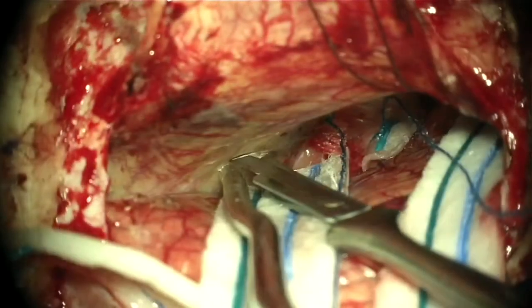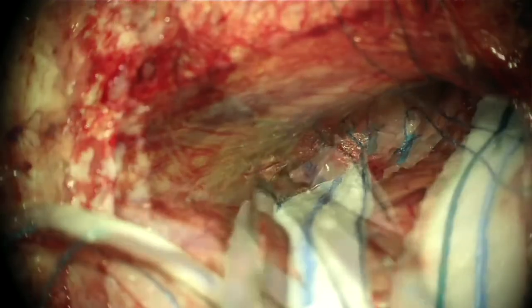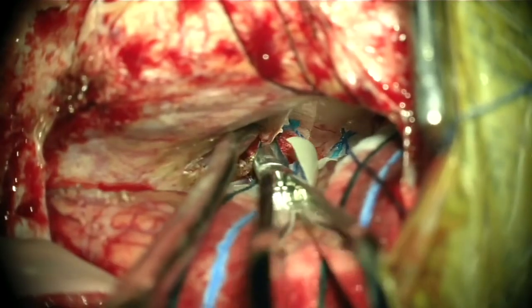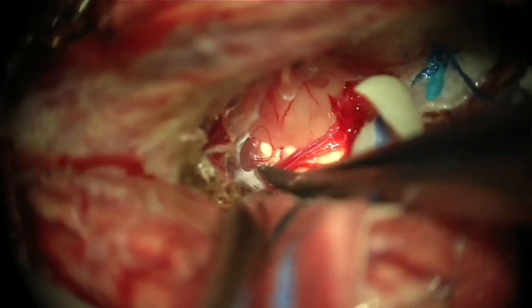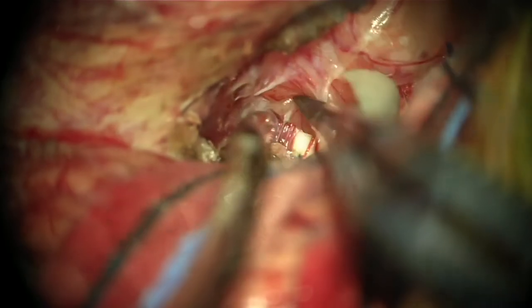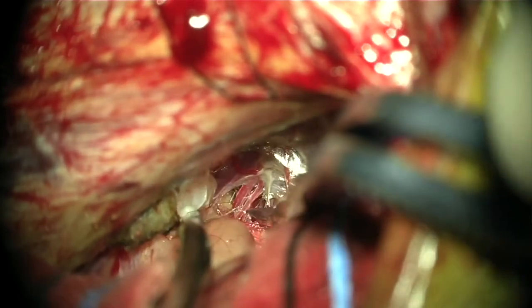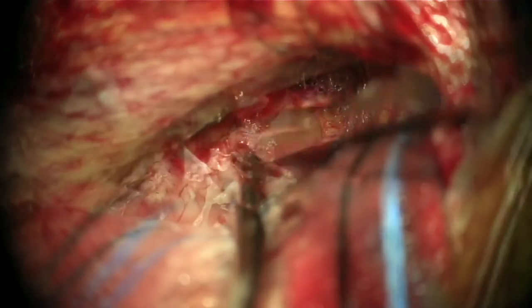I am coagulating the tentorium, and I am going to cut the tentorium in a transverse fashion, from lateral to medial, just enough to provide supratentorial access so I can see the portion of the tumor that is above the tentorium, and with this cut I can communicate the supra- and infratentorial aspects of the tumor. We can see that large vessel — that is the posterior cerebral artery before its bifurcation into calcarine and parieto-occipital arteries — and I continue working on dissecting the tumor from all the surrounding neurovascular structures.